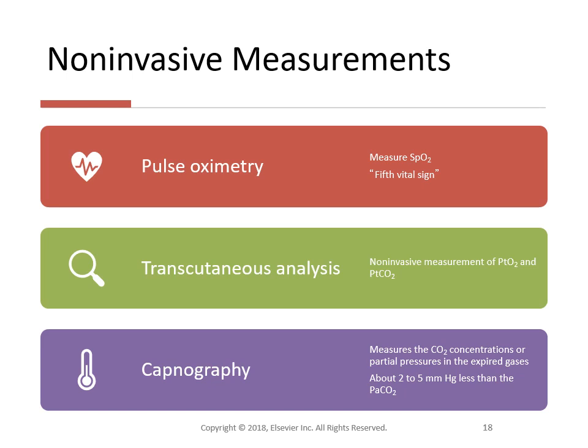Capnography involves the measurement of CO2 concentrations or partial pressures in expired gases and their real-time graphic display during breathing. Measurement is based on CO2 absorption of light in the infrared spectrum in proportion to its concentration. A capnograph employs a light source and a photodetector that measures changes in the intensity of infrared light passed through an analysis chamber. The primary application of capnography is to monitor patients during general anesthesia, mechanical ventilation, or resuscitation.